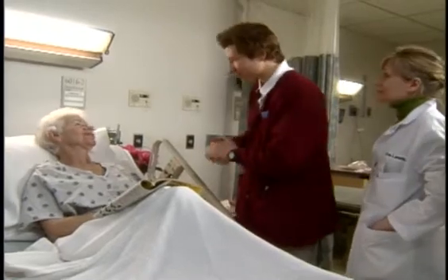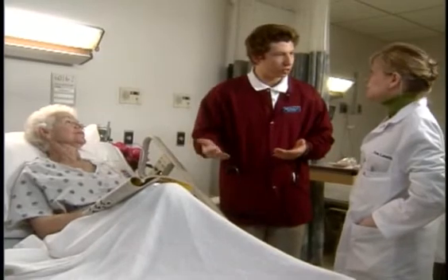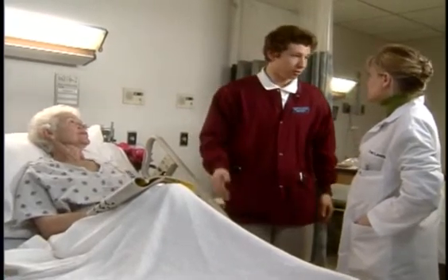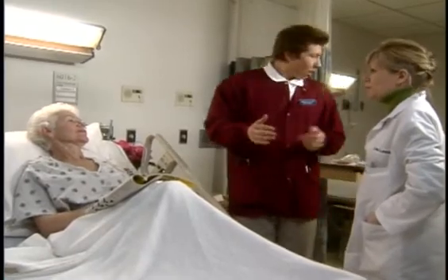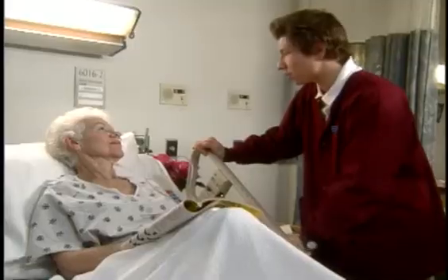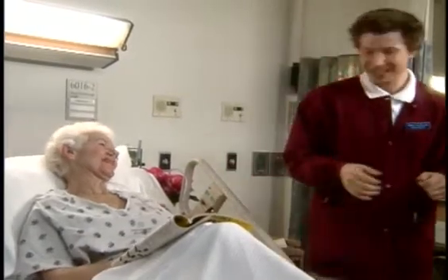Thank you. You're welcome. Okay, I think we're finished. Now I'll just document the procedure, noting the liters of flow per minute and the patient's response to the therapy. Okay, Mrs. Keene, we're all finished. I'll be back to recheck your oxygen level now that we have you on the oxygen. Thank you, darling. You're so welcome. Have a good day.